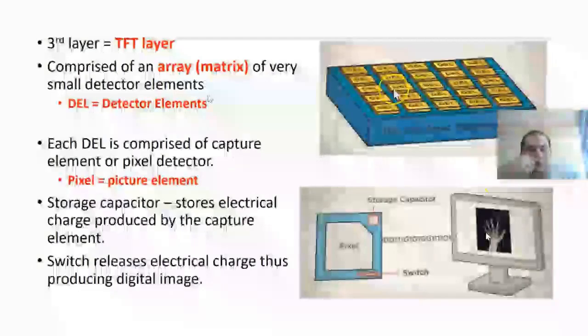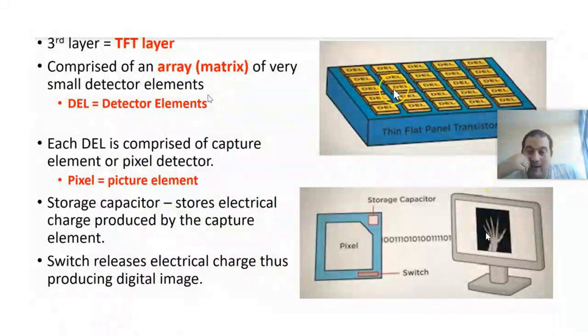This situation occurs, but there must be a mechanism in place for this reason. Let's assume today your data is lost for any reason. You need to have a way to store the data. This happens in no time, doctor, but there must still be a mechanism in this way. Why should we have a storage capacitor? Because we need to store the data.